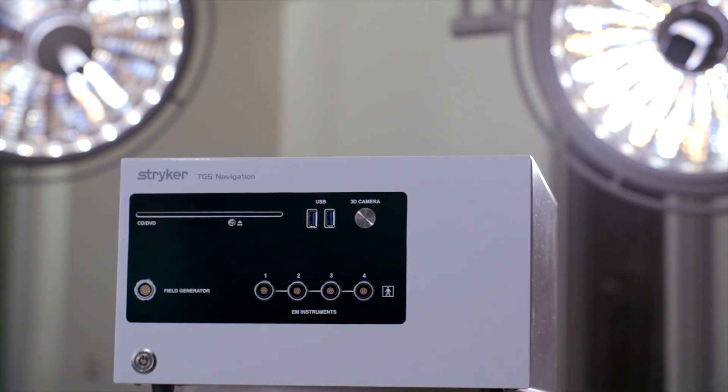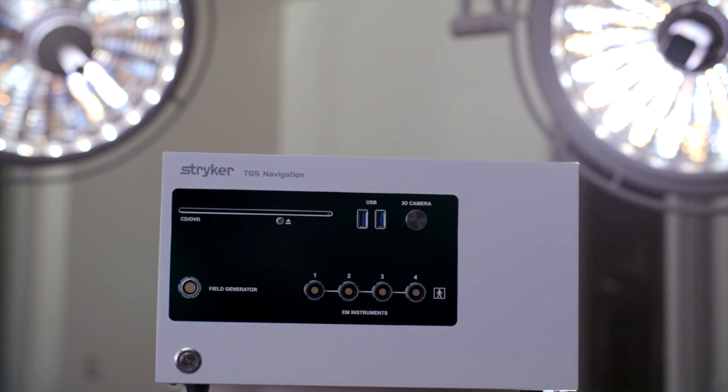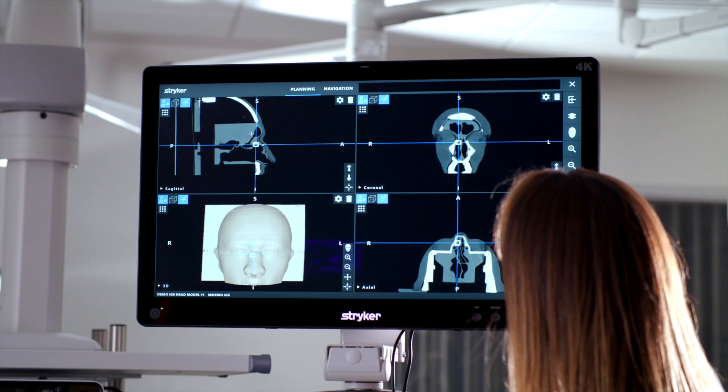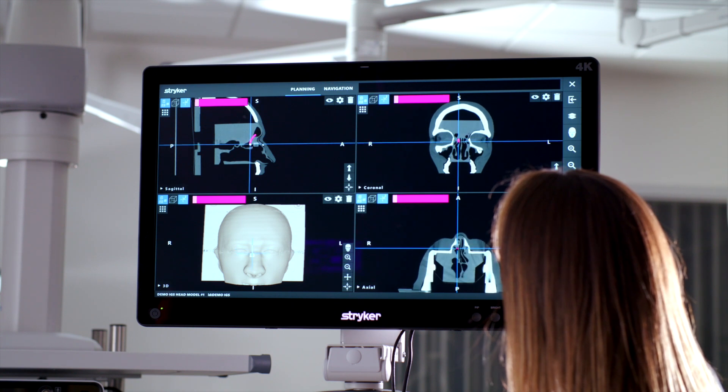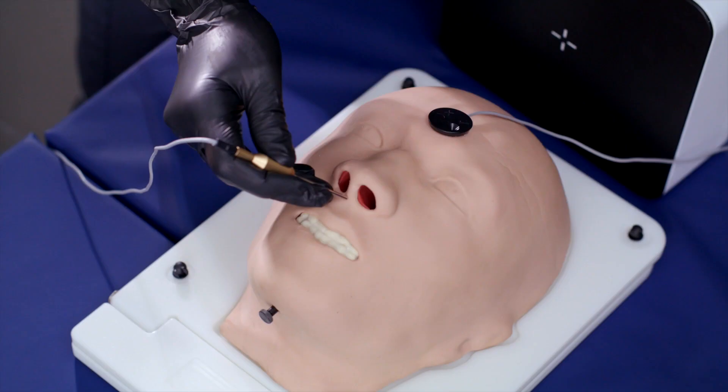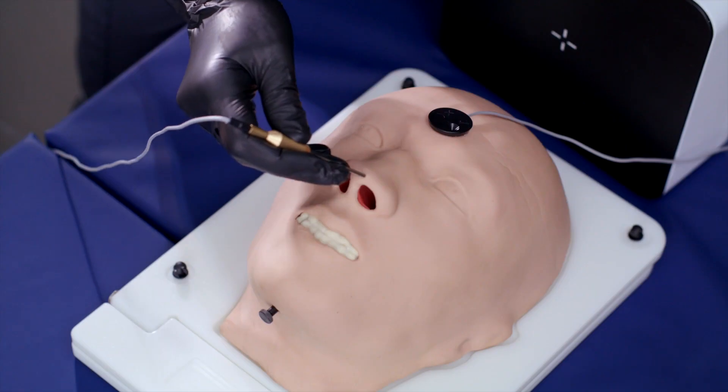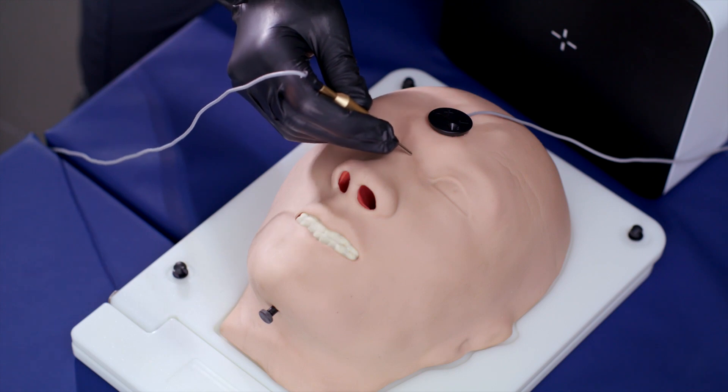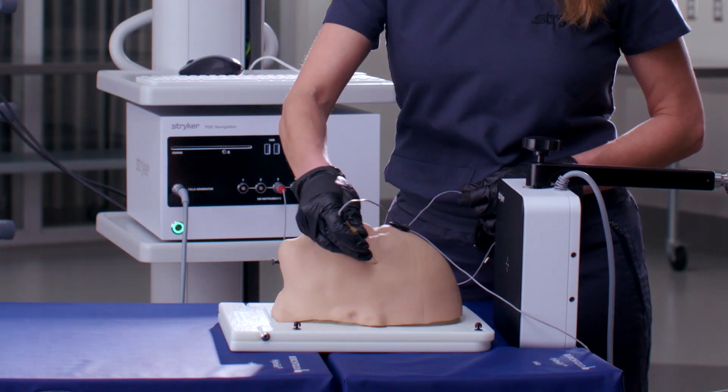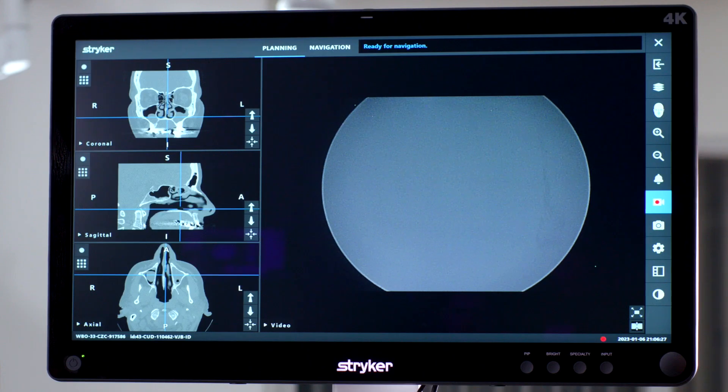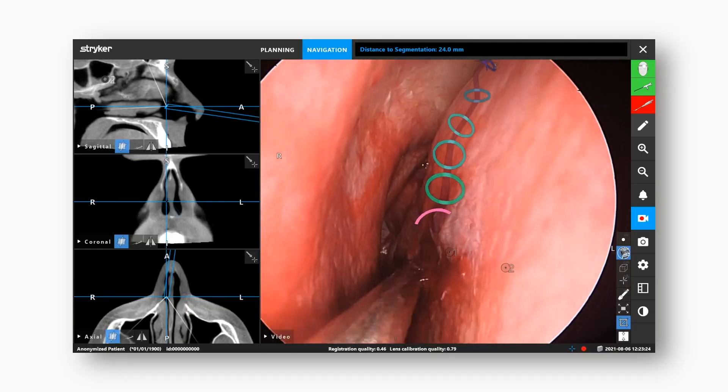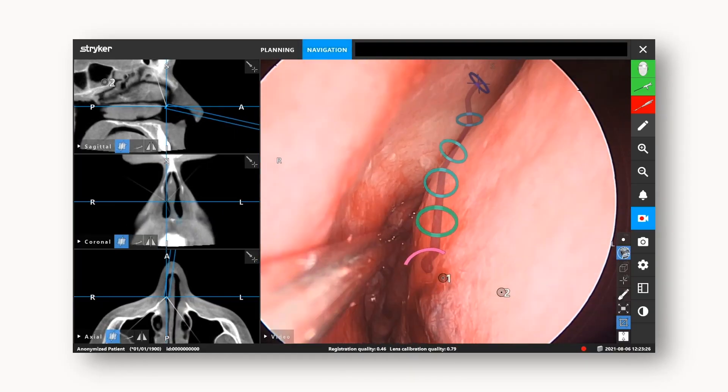The Stryker ENT navigation system, powered by Scopus software, is designed with the ENT surgeon in mind. Surgeons can have more complete visibility and assurance by combining standard-of-care electromagnetic technology with groundbreaking target-guided surgery and augmented reality.